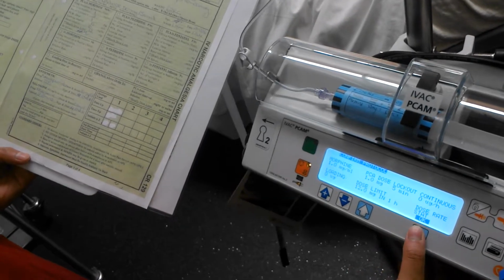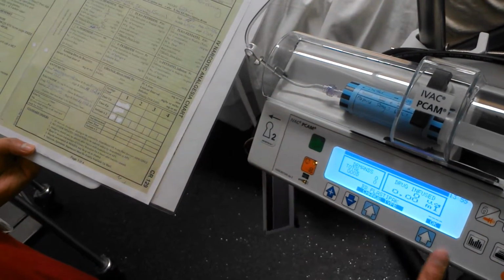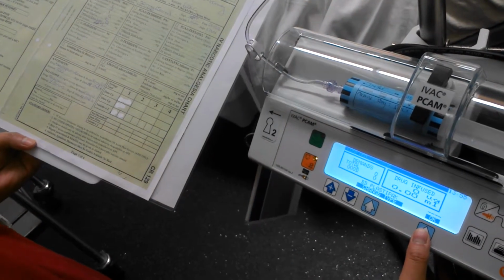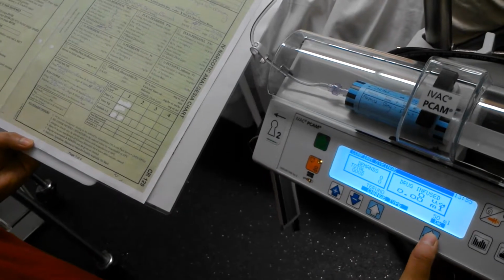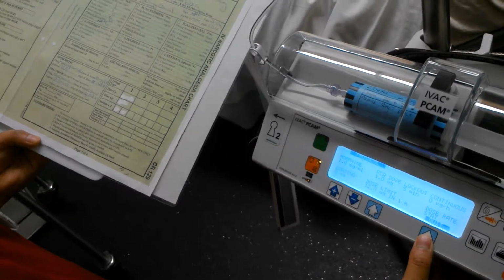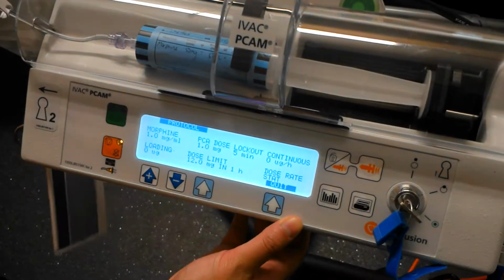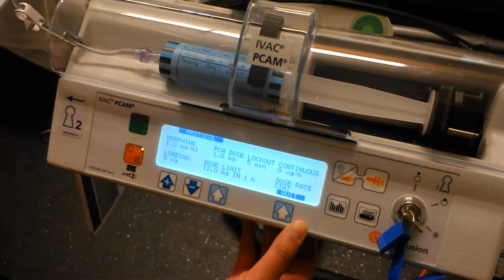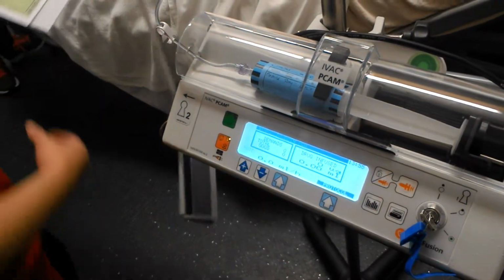And then okay. Okay, and this is that. Change it to remove. Okay, and as shown, this is my criteria. Okay, and I'll connect this to the patient now.